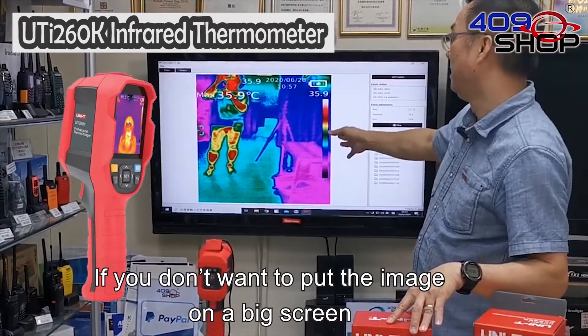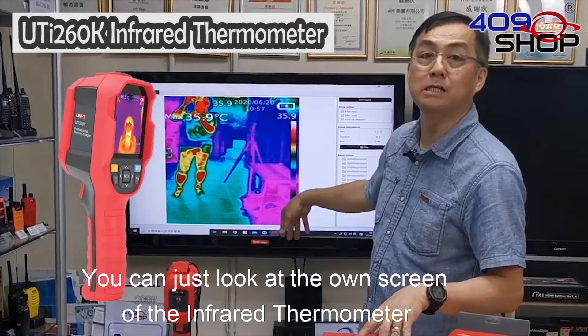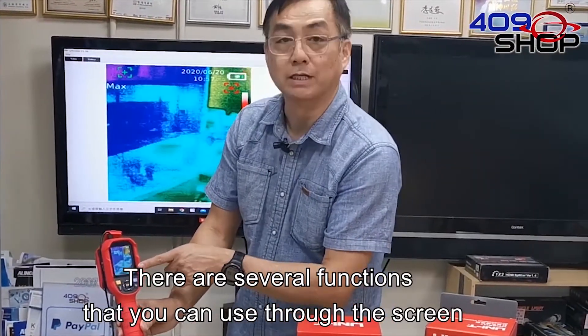If you do not want to put the image on a big screen, you can just look at the own screen of the infrared thermometer. After you connect it to the TV or computer, there are several functions that you can use through the screen.